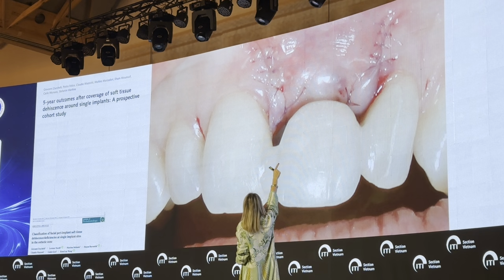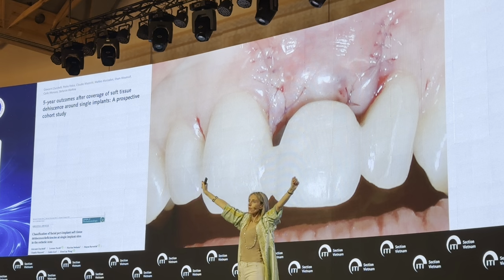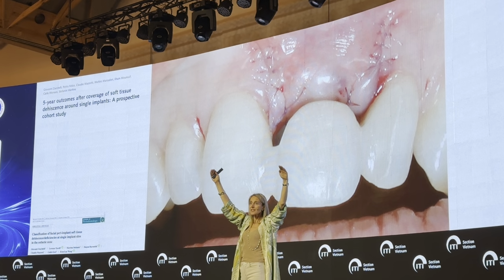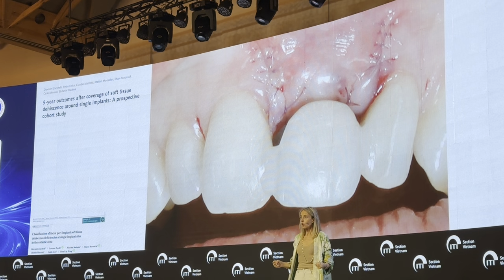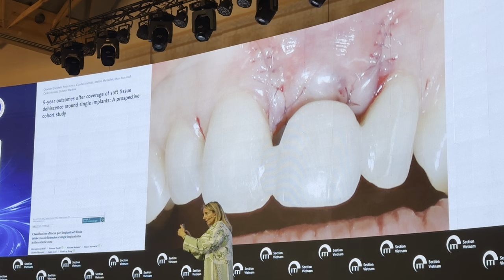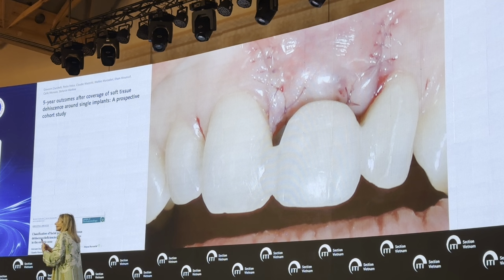And thanks to the suture in the most apical extension of the vertical releasing incision, performed taking the periosteal anchorage, I stabilize the bottom of the vestibule, and from this apical bottom of the vestibule, I stretch the alveolar mucosa to cover, in that case, the implant or around teeth the recession, without any vestibule depth reduction. In some cases, obtaining even an improvement of the vestibule depth.